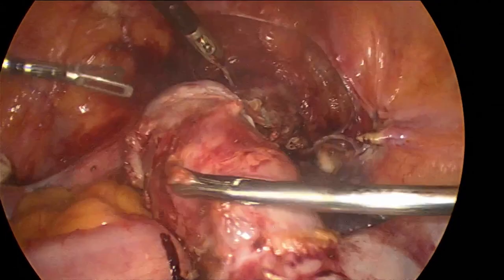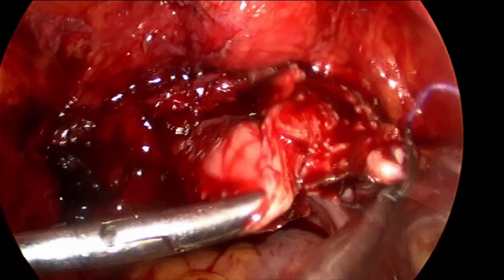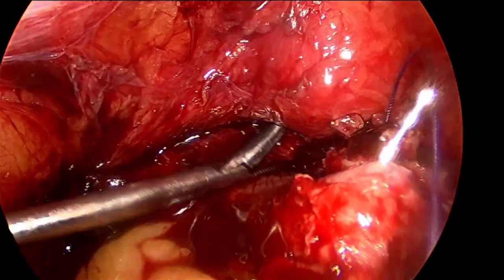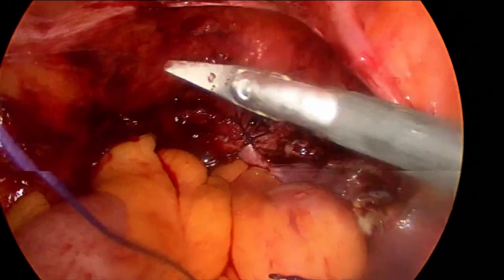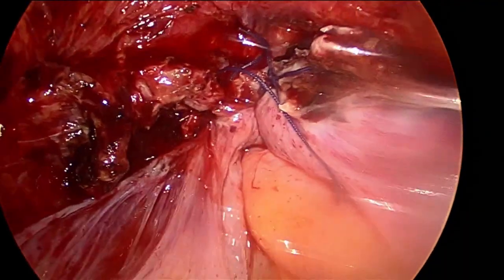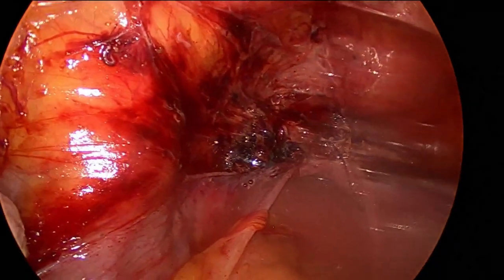Now the uterus is separated from the vagina; the uterus was held with the help of the needle holder and pushed outside from the vagina. The vaginal wall was then sutured with number one Vicryl in figure-of-eight sutures, incorporating both uterosacral ligaments to prevent further vault prolapse. This is the final picture after the hysterectomy and suturing, and we applied safeguard solution to stop the minor oozing.